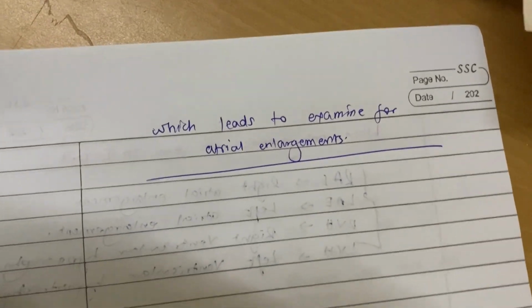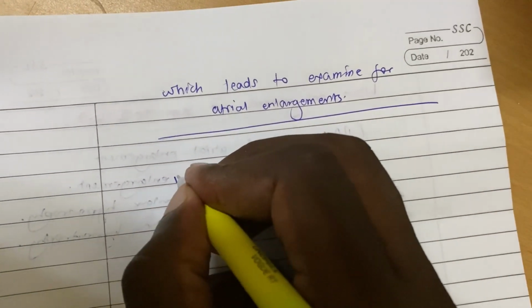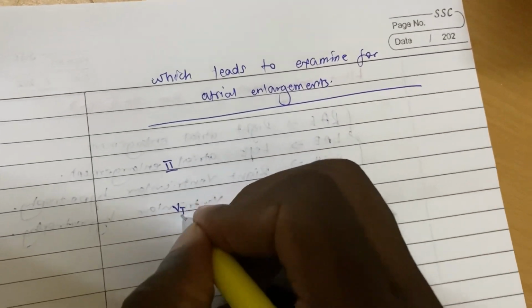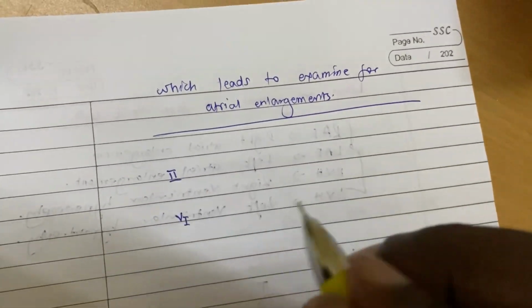We're going to use lead 2 and V1, especially lead 2 and V1.